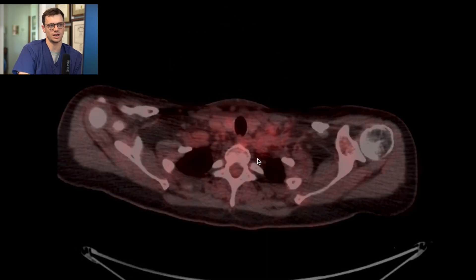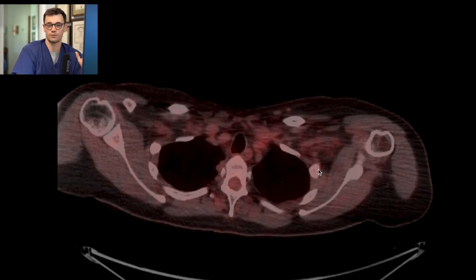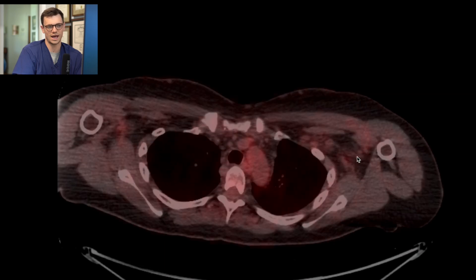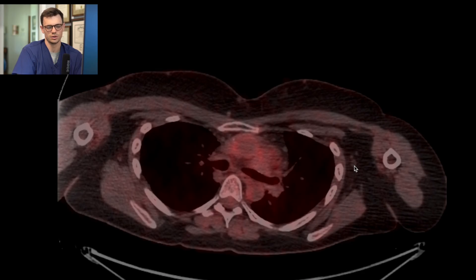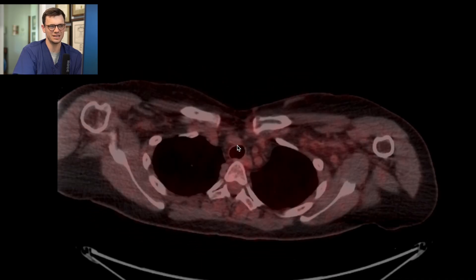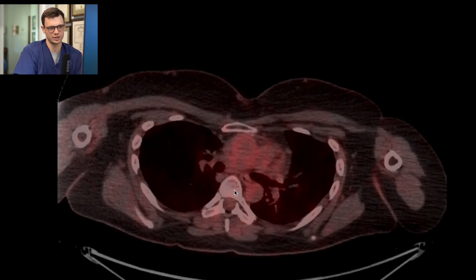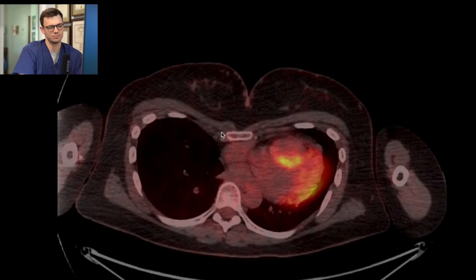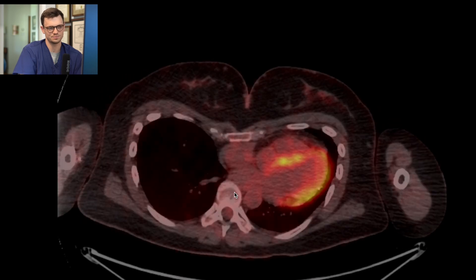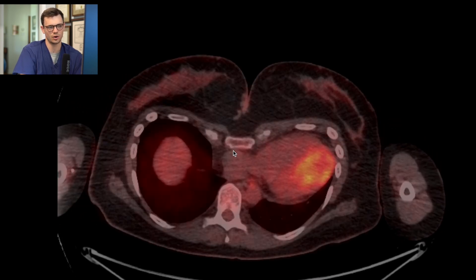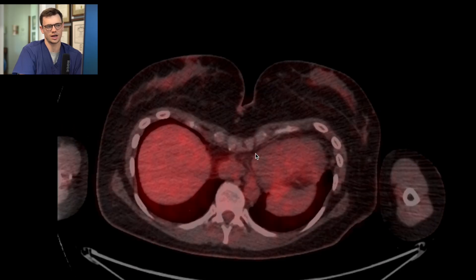After the head, I go down to the chest. Important things to think about in the chest are first lymph nodes. You have axillary lymph nodes — these are all normal looking, with a normal morphologic shape, fatty hilum, not really hot, not taking up a lot of glucose. You've got mediastinal lymph nodes that hang out by the vascular structures within the mediastinum. Specifically with breast cancer, you want to look for internal mammary lymph nodes along the chest wall adjacent to the sternum — I don't see any pathologic ones here. You've also got posterior mediastinal nodes by the spine and epicardial nodes, which this patient does not have.